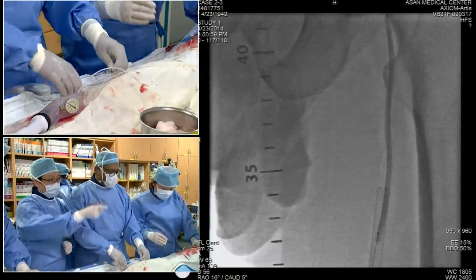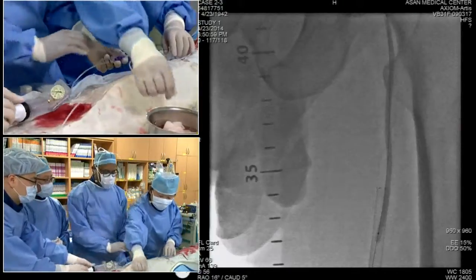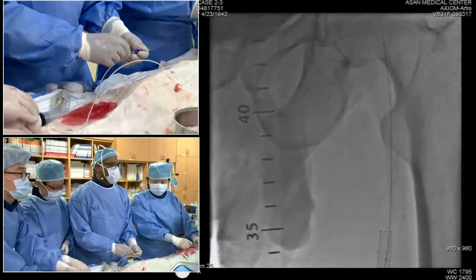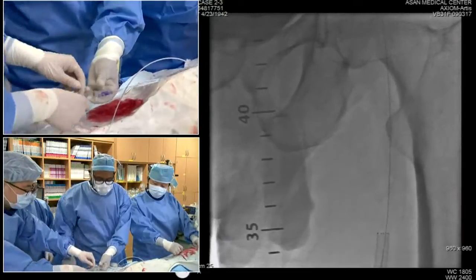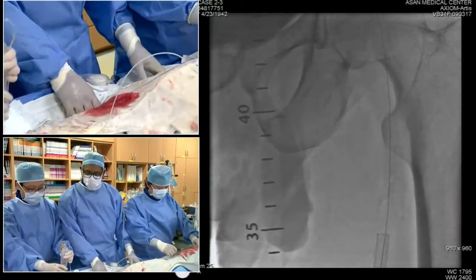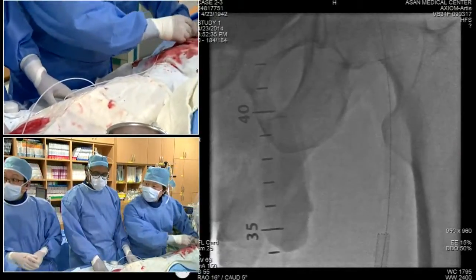Okay. So the balloon that you're looking at right now is 3 by 120 millimeter. Yes. Dr. Laird was the national co-PI on the SFA Impact trial, and the usual drug-eluting balloon protocol is a pre-dilatation with a balloon diameter.